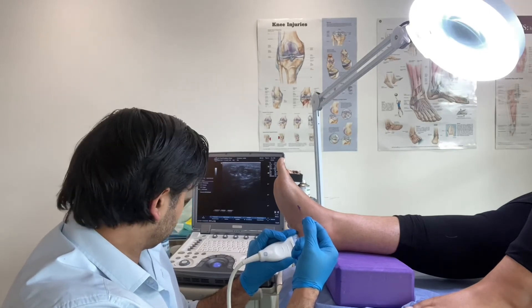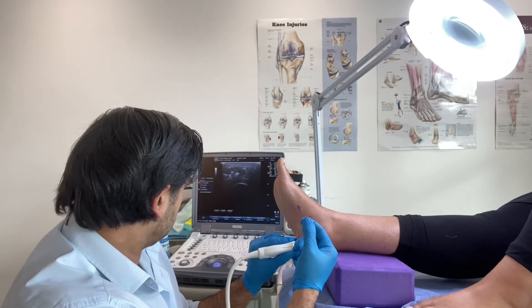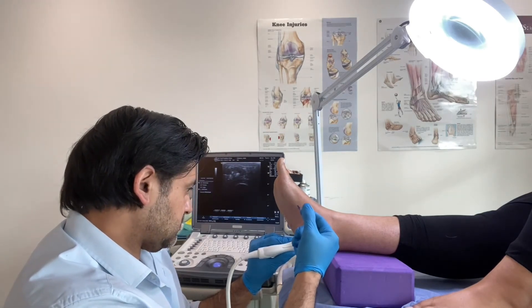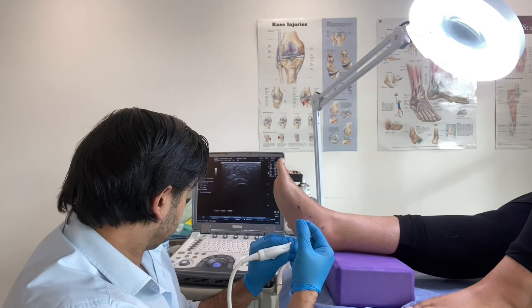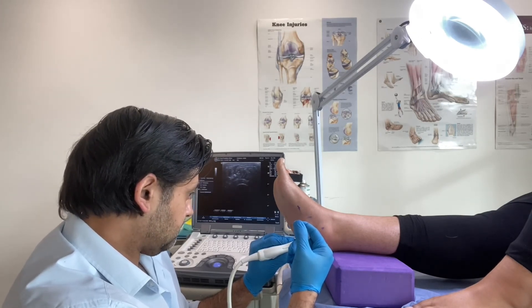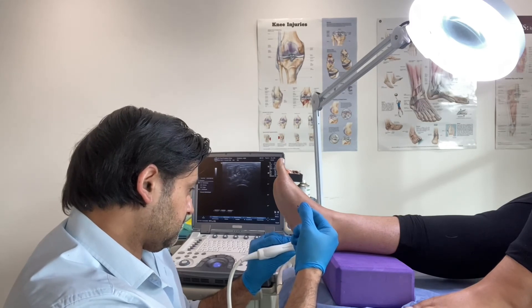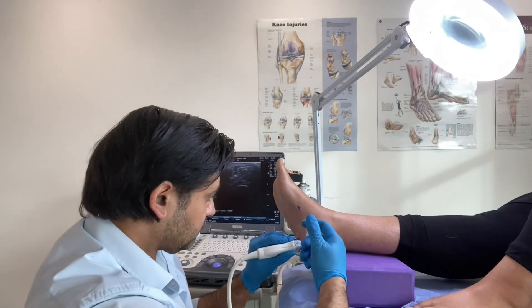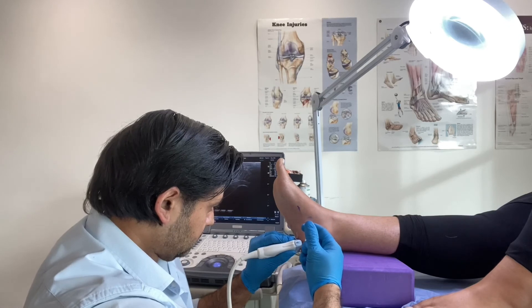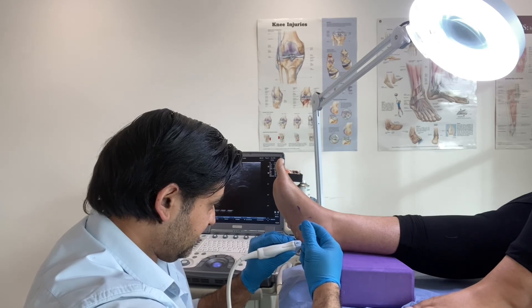That's the general for which you're here. It's easy to come back. Just a little bit more. I'm sorry — just a little bit more. Are you okay? Can you feel anything? It's just numb now.